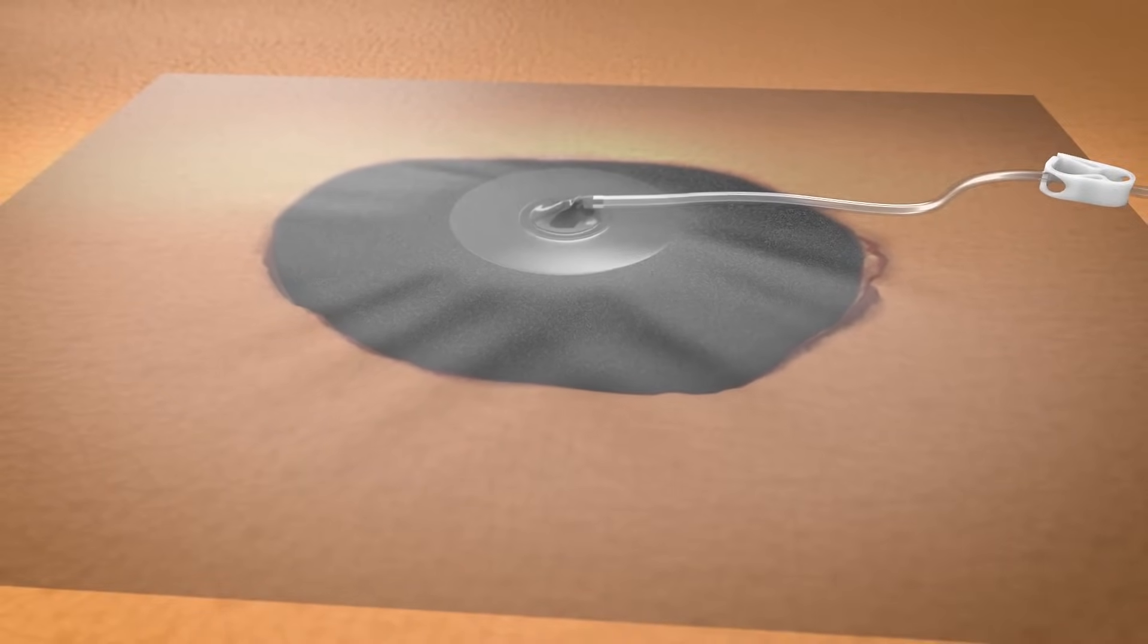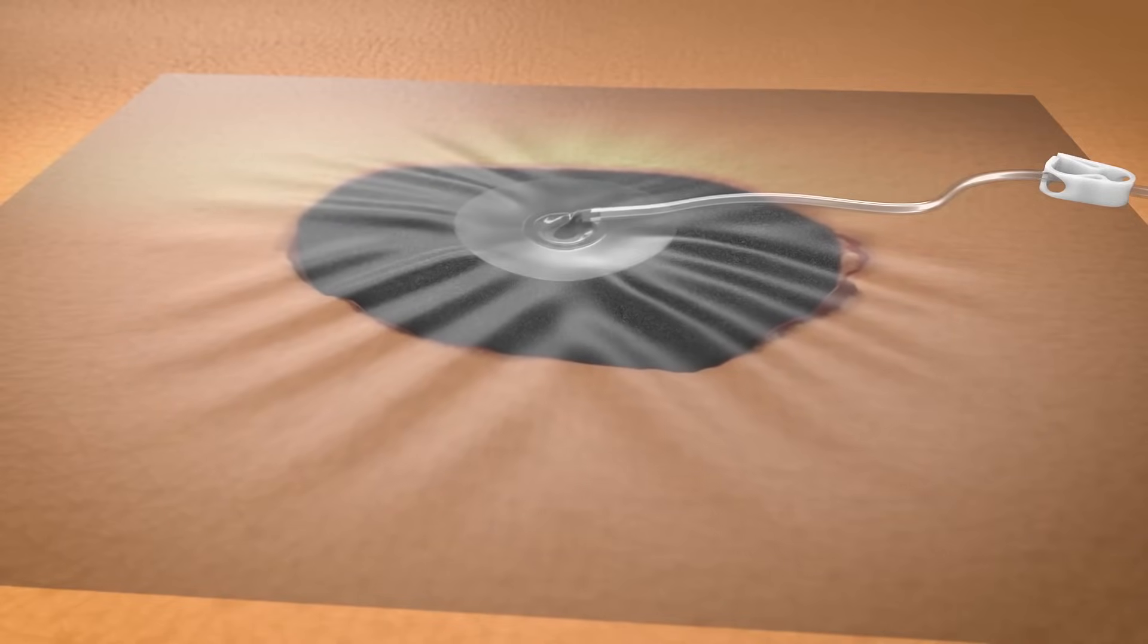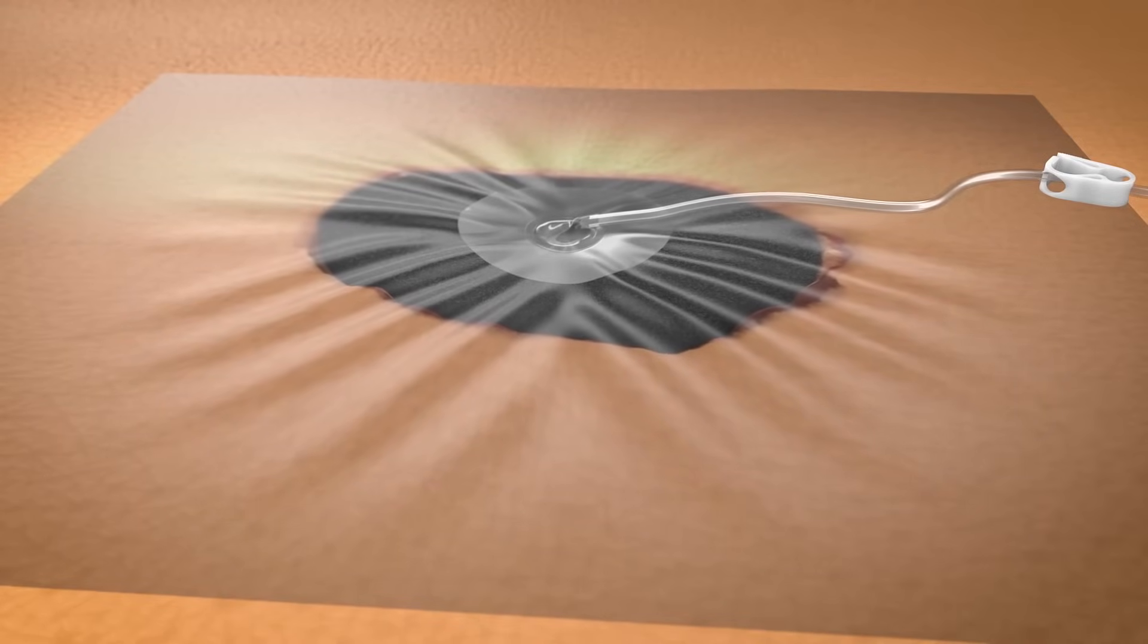3M sensor track technology helps provide uniform negative pressure to the wound surface. It also provides alarms when there are conditions that would impact negative pressure wound therapy.